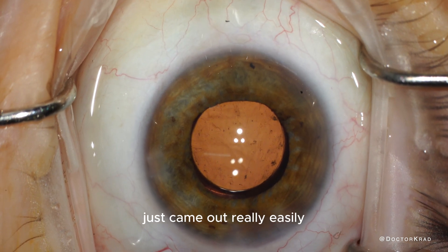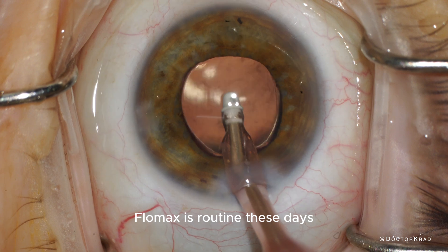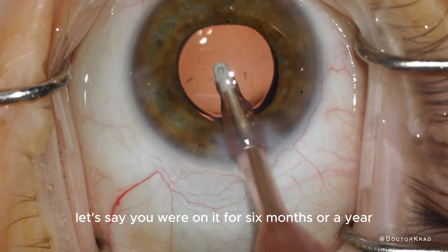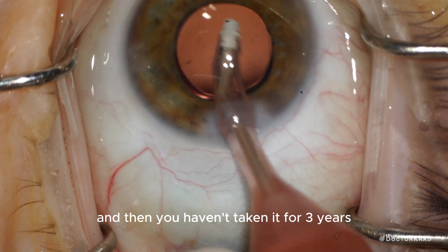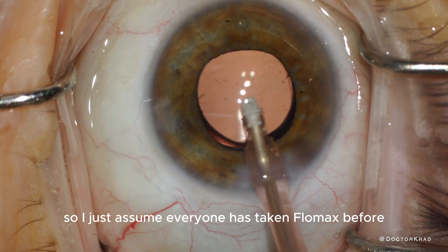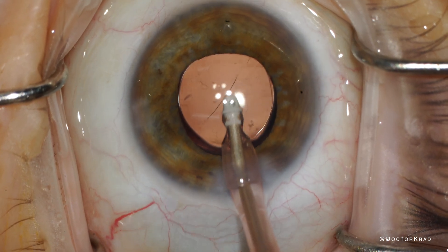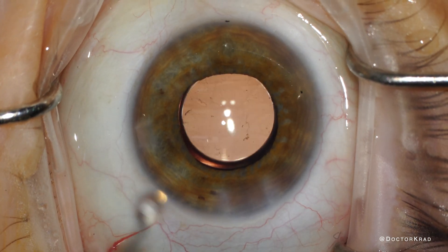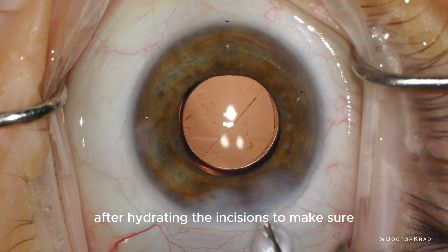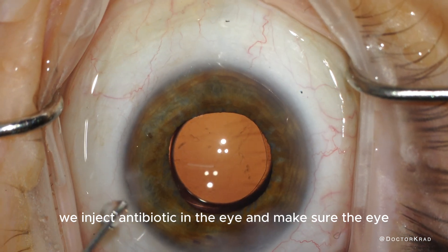I flip the manipulator upside down and pull it out of the eye. Usually three loops come out very easily; the last one is under the incision, so I have to burp it out carefully to avoid trauma — and as you see, it just came out really easily. Performing cataract surgery on a patient taking Flomax is routine these days. Even if someone's not currently on Flomax, I assume they may have taken it in the past, because prior use — even years ago — can still affect pupil dilation. I just assume everyone has taken Flomax before. Here I'm removing the viscoelastic gel and sealing the incisions by hydrating the right, left, and roof.